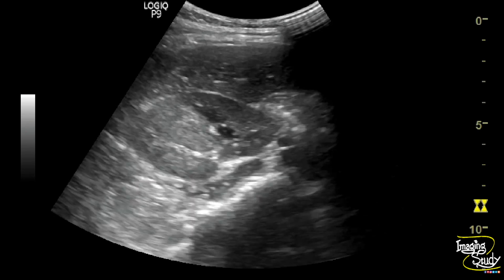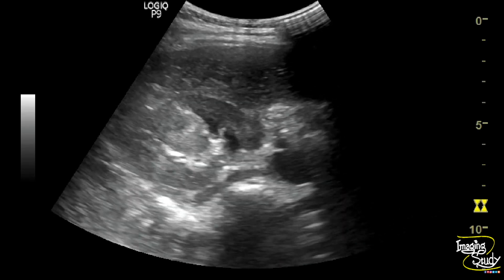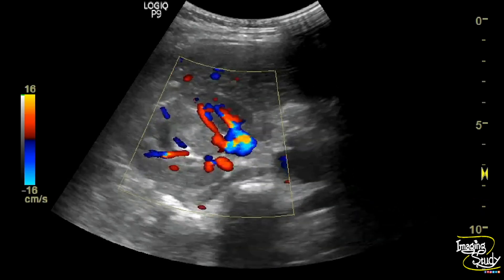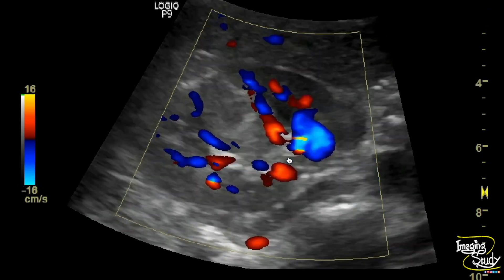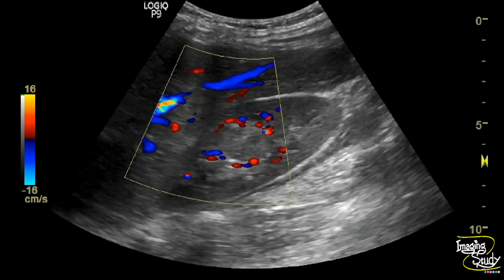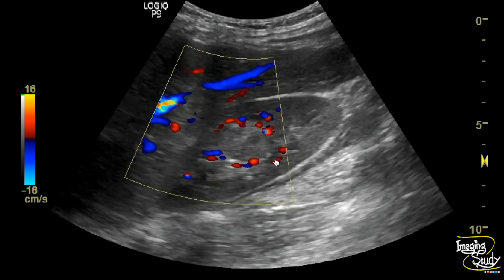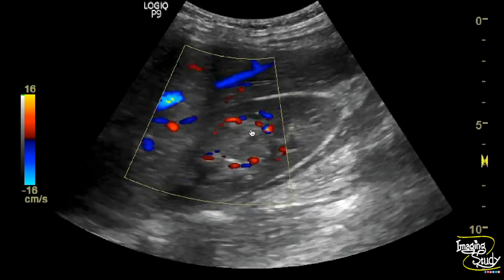On transverse section, you can still see this lesion extending up to the cortical region and causing slight compression over the adjacent renal sinus. Here on color Doppler, this lesion is showing a peripheral rim-like vascularity.